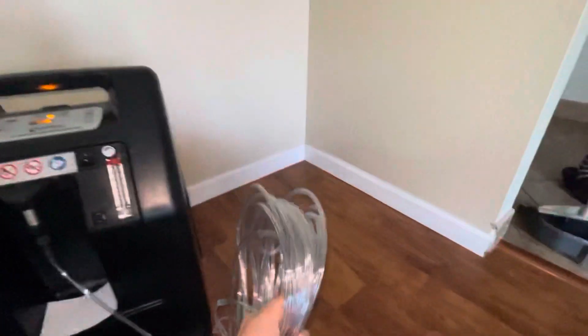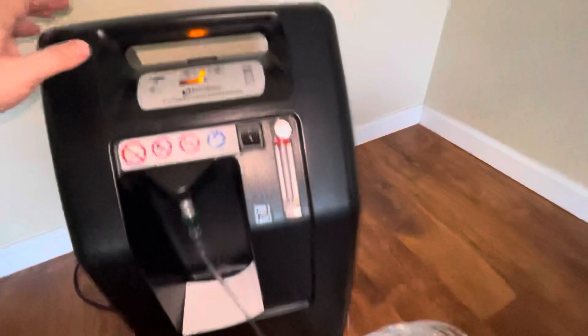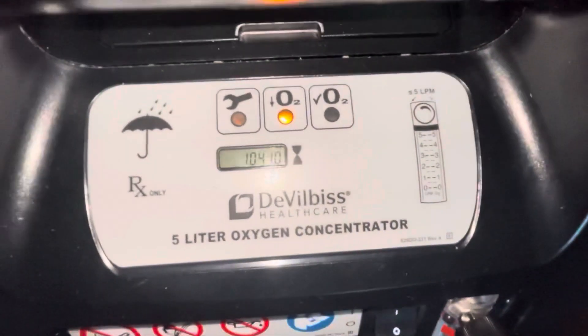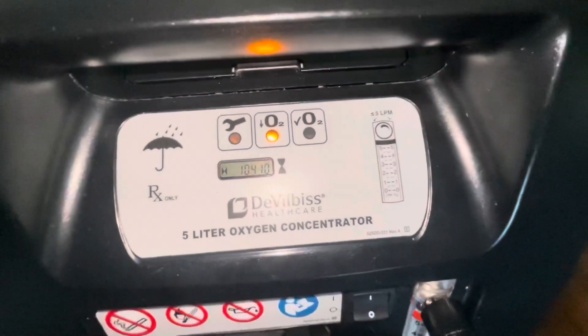You don't want any flammable devices or smoking near it — it is oxygen, which can be flammable and dangerous. It comes with 50 feet of oxygen tubing so you can roam around the house without having to move the machine with you everywhere.